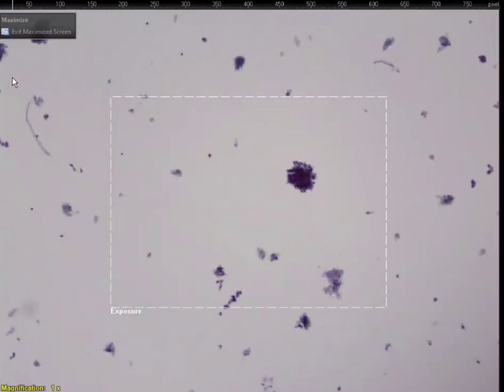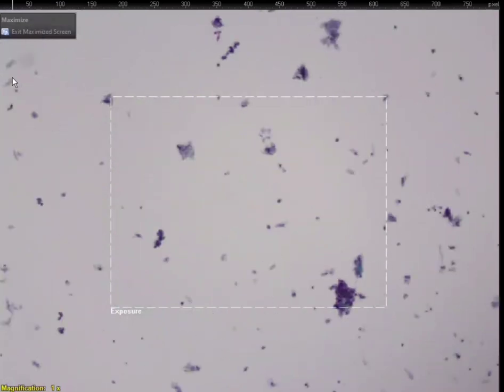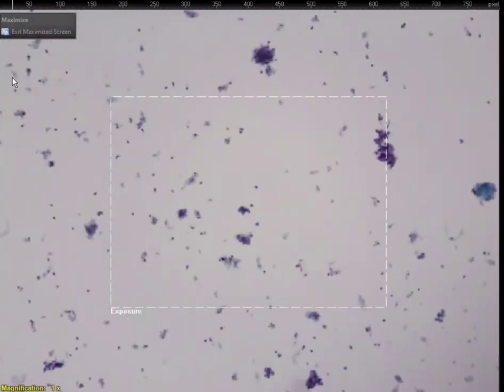So we can say this, we're not satisfied with the sample, couldn't we? It's suboptimal. There's not enough lymphocytes. Dr. Molu, what would you say? I would still report on what we see. You'd report on what we see, but would you say suboptimal? Yeah, I would agree. Yeah, suboptimal, very few lymphocytes, and a large amount of respiratory epithelium contaminating our sample.